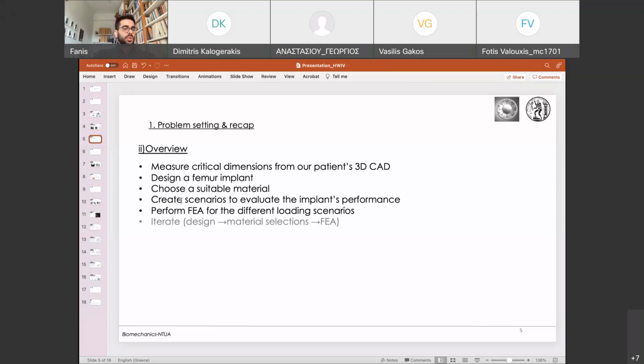Then we will go into choosing a suitable material and deciding on some scenarios where we can evaluate the implant's performance, essentially how it's going to be used in daily life. What our patient is going to do with this femur implant, how long he's going to stand, if he's going to run, walk, or jump or whatever. And finally, we're going to perform a finite element analysis for the different scenarios we decided on, and just see if there's a problem, if the implant can hold, if it can't, if it needs any improvements.